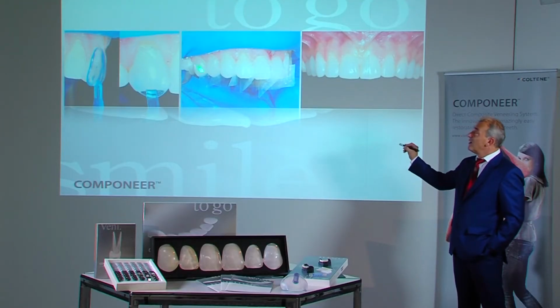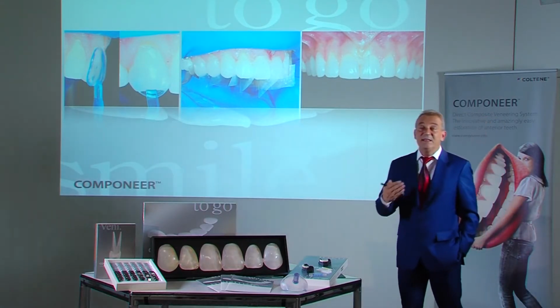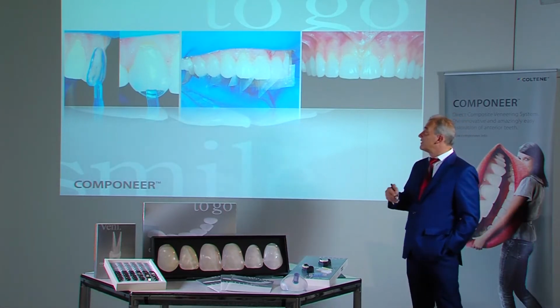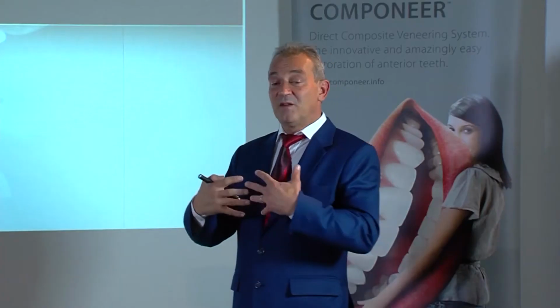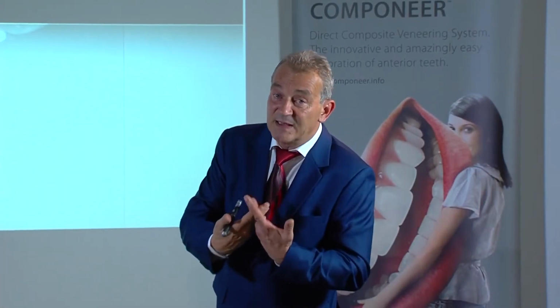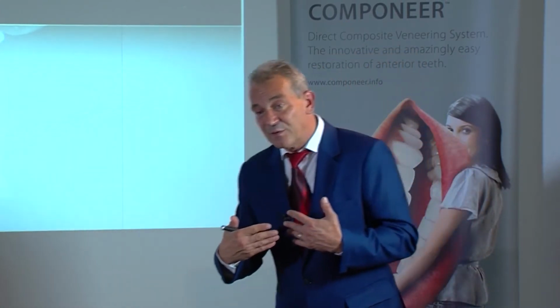In this case, there was no major discoloration in the cervical area and the dentine had virtually the same color of the teeth. If we cover cervically with normal translucent enamel material, we obtain a profile from the brighter surface to the cervical edge at the same time.